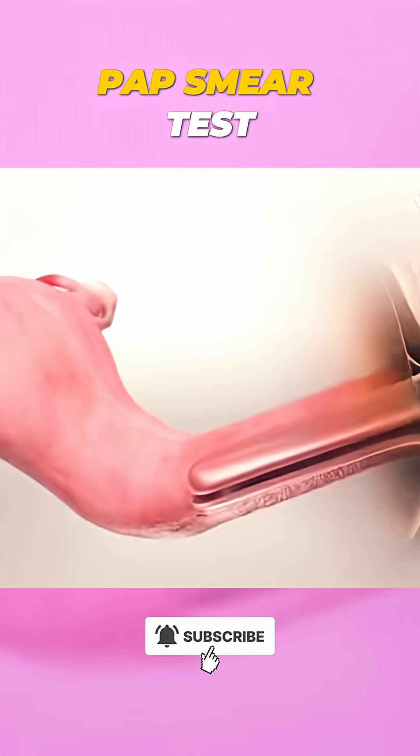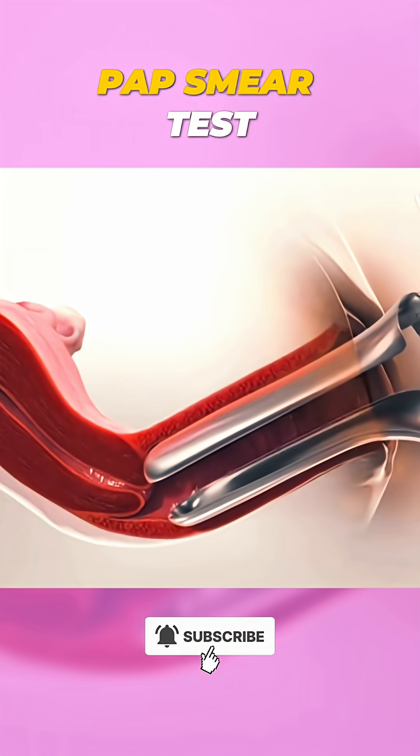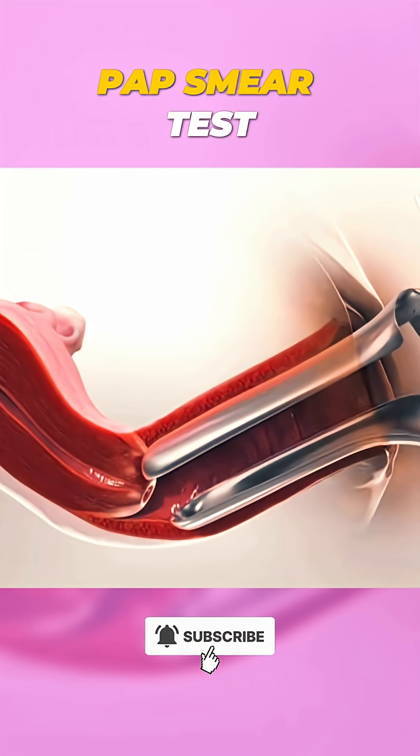The provider gently inserts a speculum into your vagina. This tool opens up the vaginal walls, allowing for a clear view of the cervix.